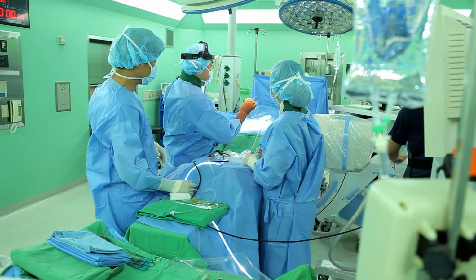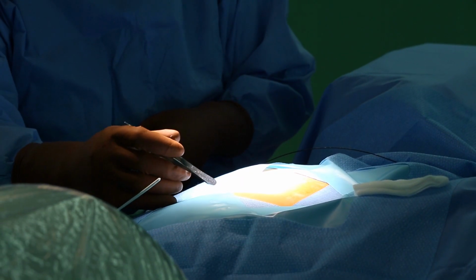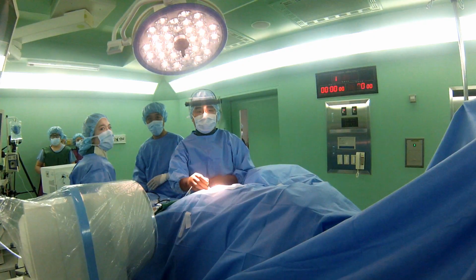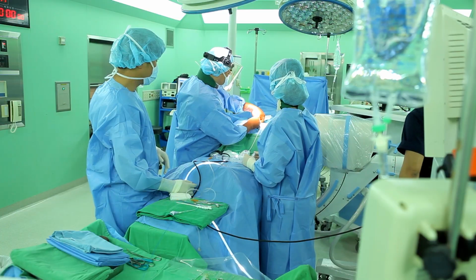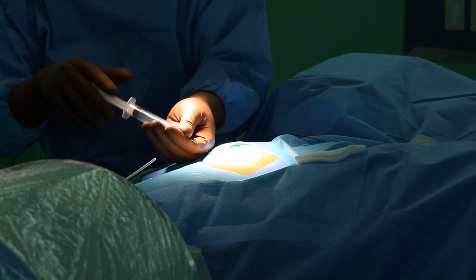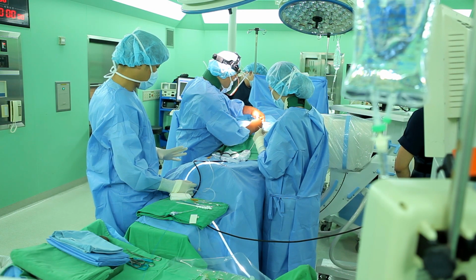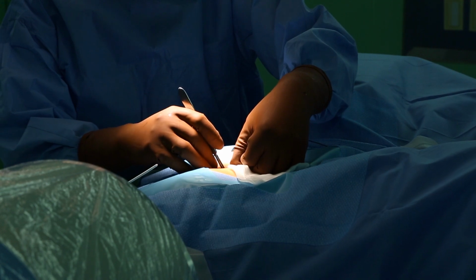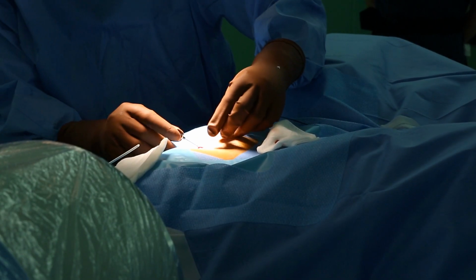You can see the approach procedure from puncture to getting to the target point. This part is the important process on which a successful operation depends. Look for the appropriate place to puncture in the area of hiatus. Injection of the local anesthetic in the area of hiatus. An epidural needle is inserted into the epidural space of the spine through the hiatus above the coccyx.